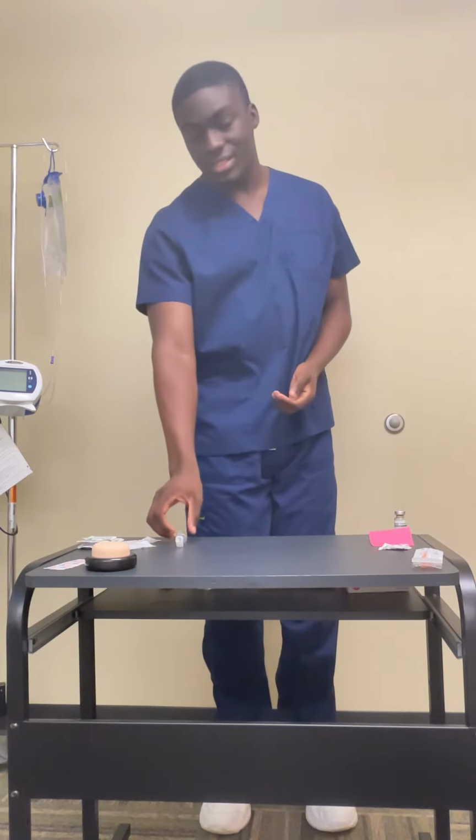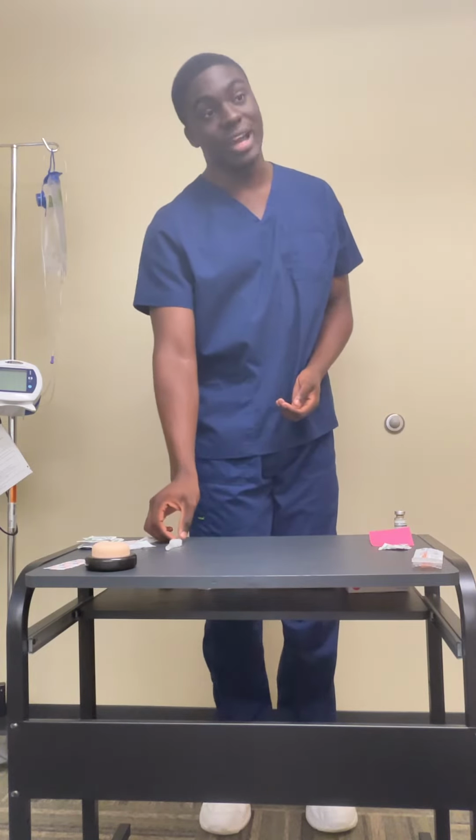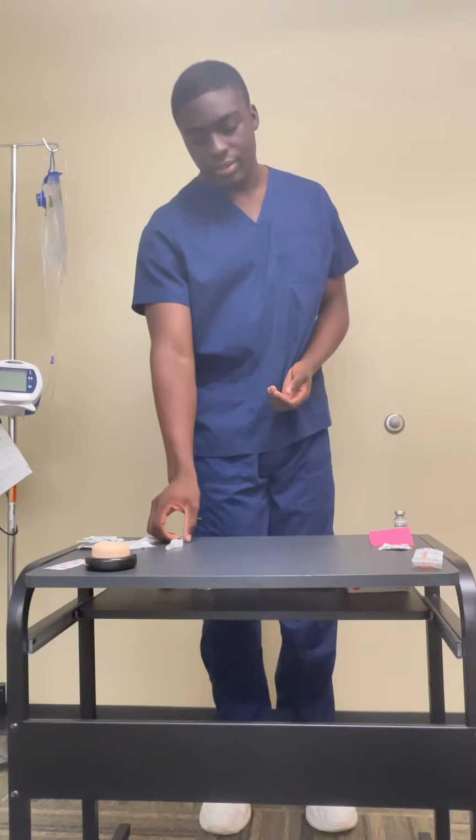And then I'll move on to, okay, Mr. Disembodied, I will be injecting your vitamin K intramuscularly. Could you tell me the last site you had it or if you've had it before? Okay, and since this is 1 milliliter, I can inject it into the deltoid and or the vastus lateralis, rectus femoris, or the ventrogluteal. But since it's 1 milliliter, I'll be injecting it into the deltoid.